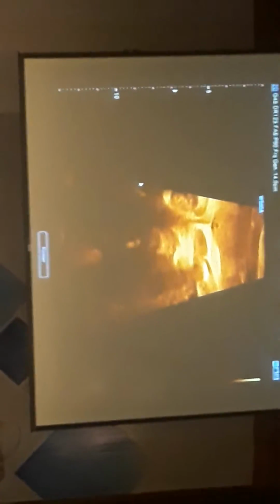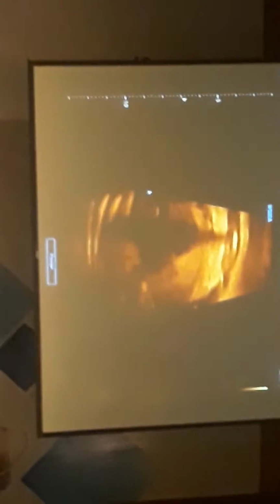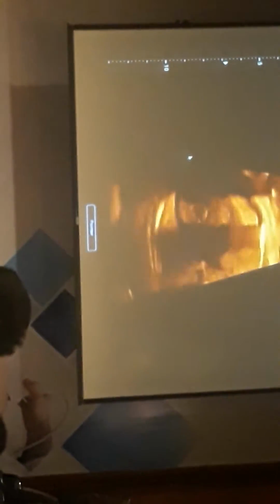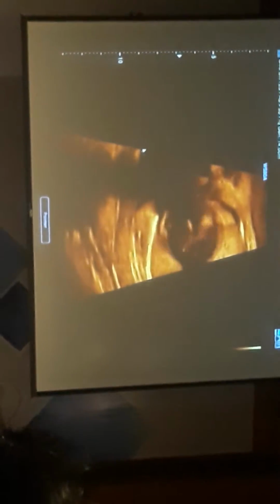But it is what I generally do, push pretty hard, but not if the patient doesn't want me to. So without pushing, I'm not going to be able to see as much because something's in the way, a leg or an arm, I don't know what it is. So here I'm finding a different window that she can tolerate.